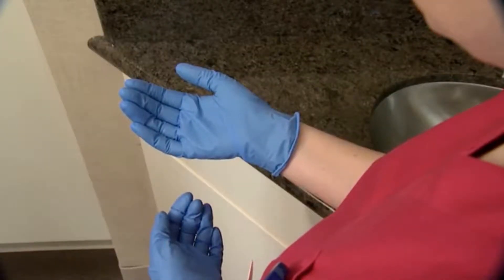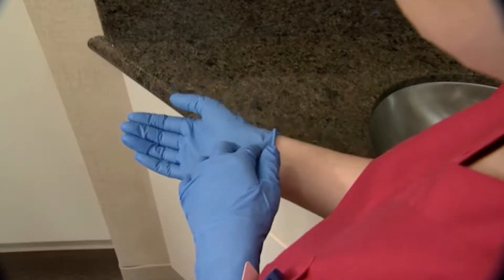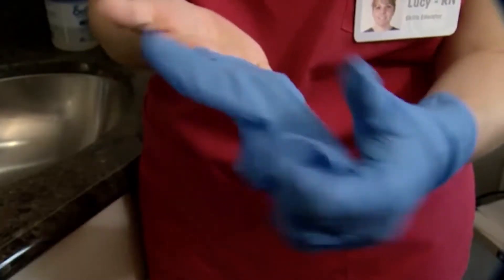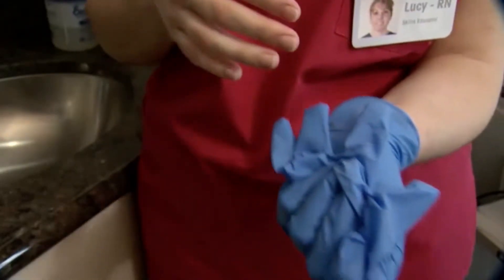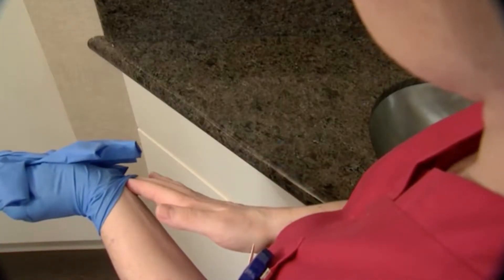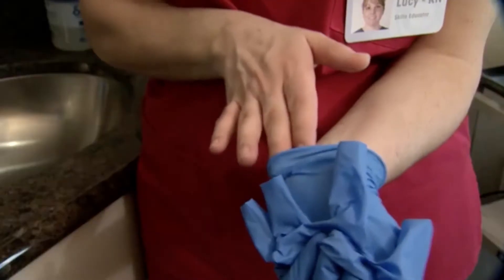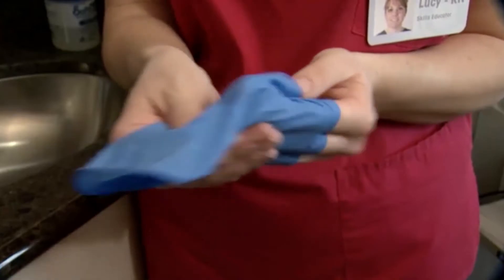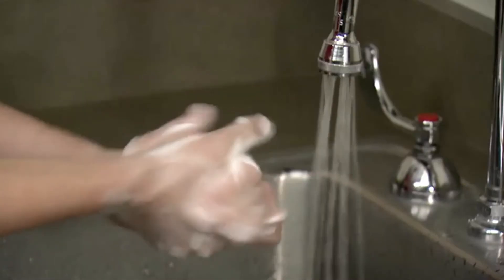To remove the gloves, protect the skin by grasping the glove at the cuff and remove the glove by rolling it inside out. Place the rolled glove in the palm of the gloved hand and remove the second glove by grasping the glove on the inside of the cuff and pulling it inside out. Dispose of the gloves and wash hands.